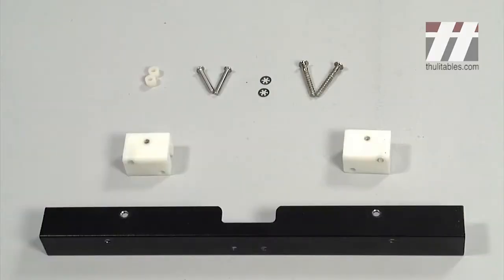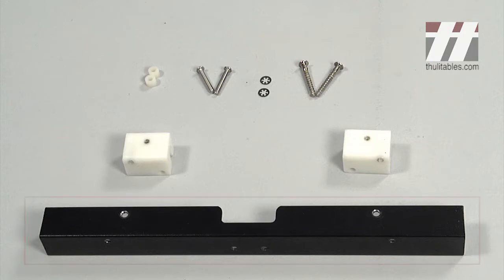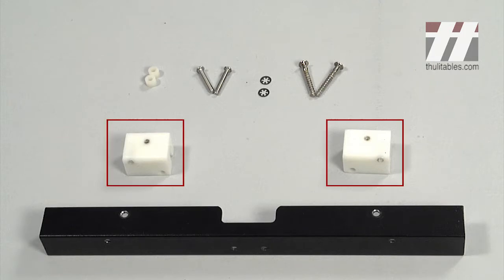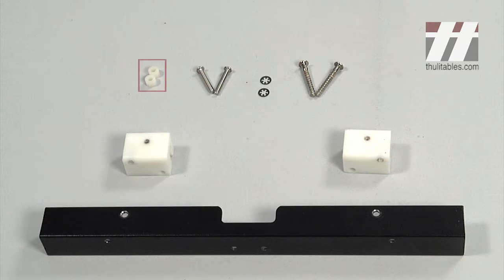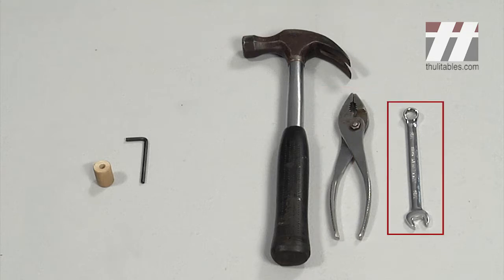Your Flexion distraction retrofit kit includes one Flexion distraction mounting angle, two Flexion distraction mounting blocks, two bolts, two spacers, two pre-waxed screws, and two retaining washers. We've provided an Allen wrench and a wood dowel. You'll also need a hammer, pliers, and a 7/16" wrench or an adjustable wrench.